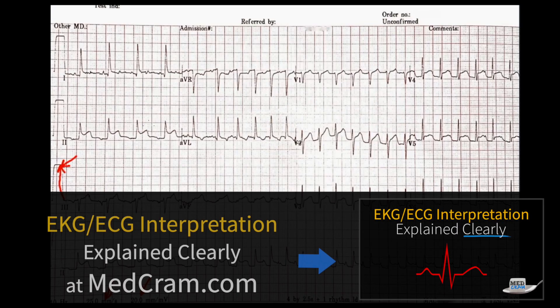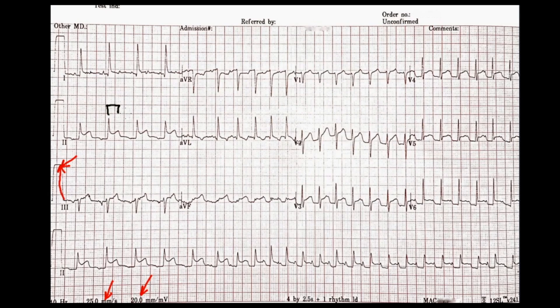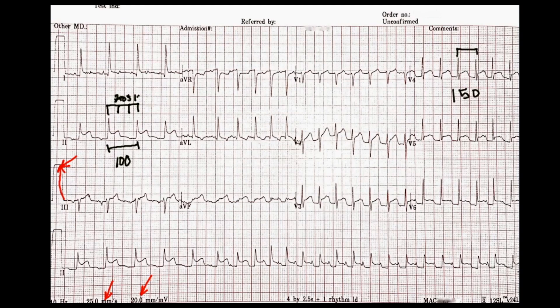Looking a bit more carefully using the box method, at the beginning you can see clearly we're dealing with approximately 3 boxes between QRS complexes. The first box is 300, the second is 150, and the third is 100. So the distance at the beginning suggests a rate of about 100. Whereas over here at the end, the number of boxes between each complex is about two boxes, giving us about 150. So we went from about 100 to about 150, and there may be an irregular rhythm.